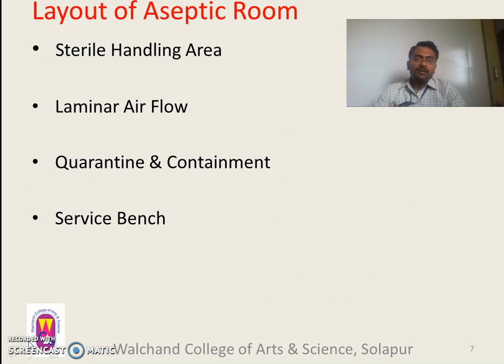Before the workers actually start their research on a new cell line, it is placed, studied and identified for any contamination in this area.